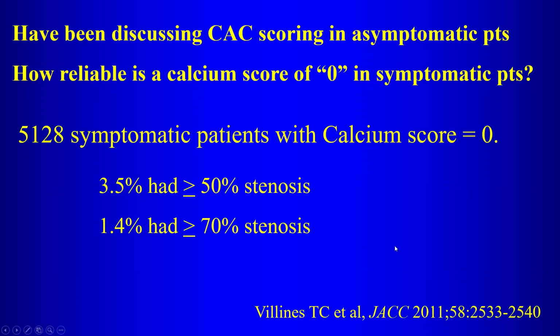Now, so far we've been discussing coronary artery calcium scoring in asymptomatic individuals. How reliable is a calcium score of 0 in symptomatic individuals? In this large study of 5,128 symptomatic individuals with a calcium score of 0, they found that about 3.5% had greater than 50% stenosis, and 1.4% had greater than 70% stenosis.